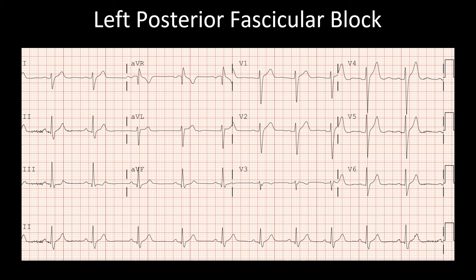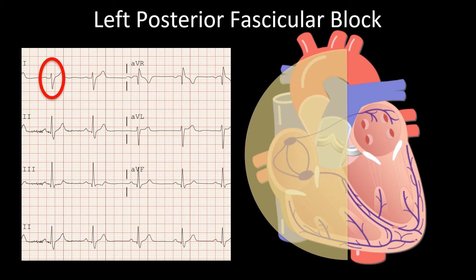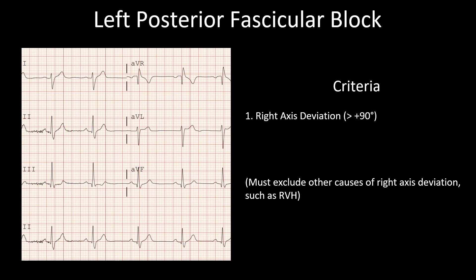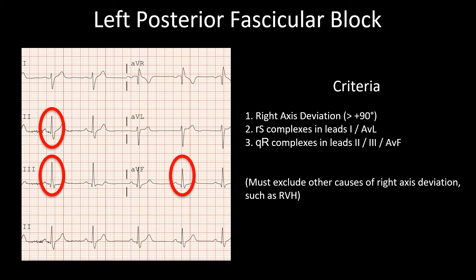Here is an example of left posterior fascicle block. The QRS is not very wide — less than three small squares. Lead 1 is negative and lead 2 is positive, indicating right axis deviation. The criteria for left posterior fascicle block include right axis deviation greater than 90 degrees, and you must exclude other causes of right axis deviation such as right ventricular hypertrophy before making this diagnosis. There is a small R and a large S complex in leads 1 and AVL, and a small Q and a large R complex in leads 2, 3, and AVF.